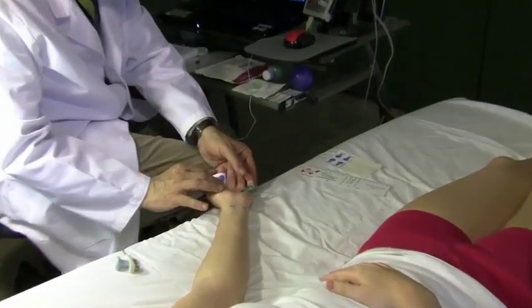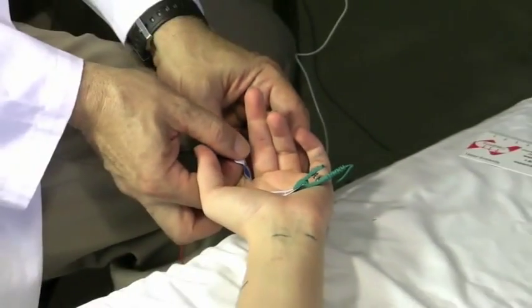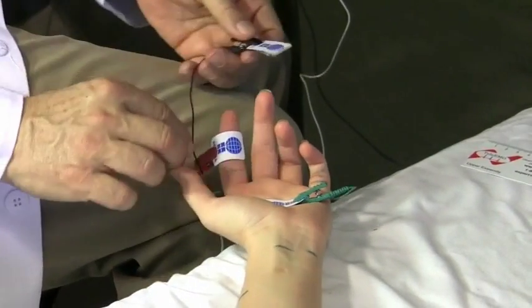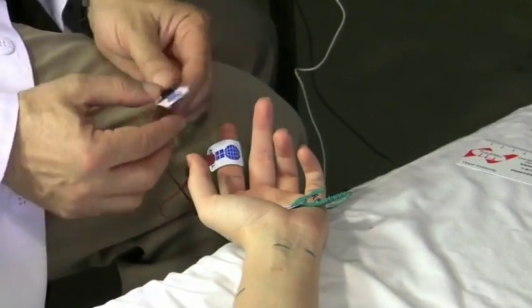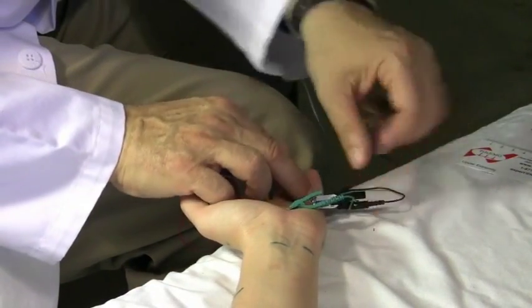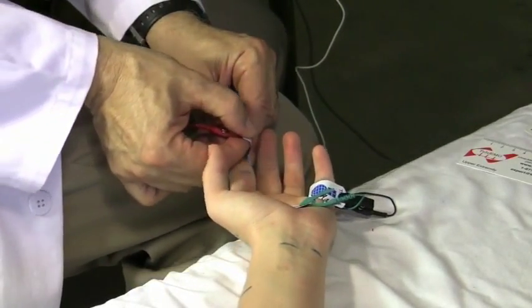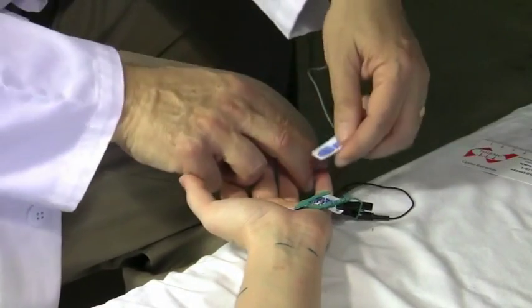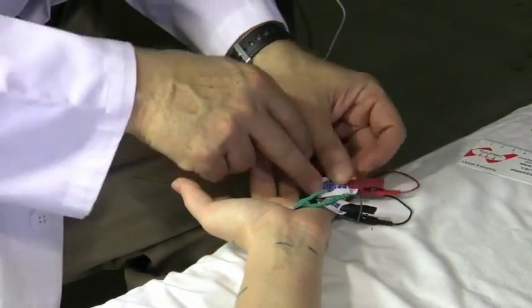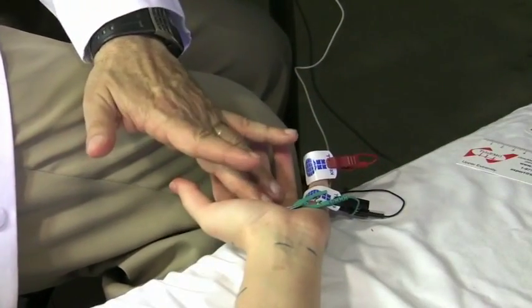And what I'm going to do, ulnar, as I said, is over the baby finger. So I take this electrode off like so. They stick nicely so that you can do a whole study with one set of electrodes. So I'm going to put this over the ulnar here. Okay, that's for the active. Take this one off and put it over the reference, like right here. Okay, and I'm going to leave the ground exactly where it is.